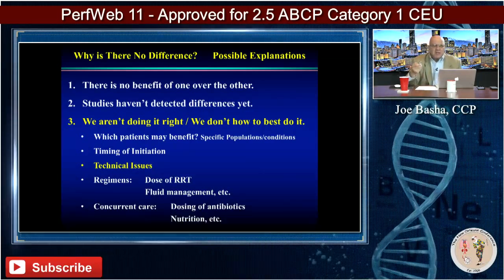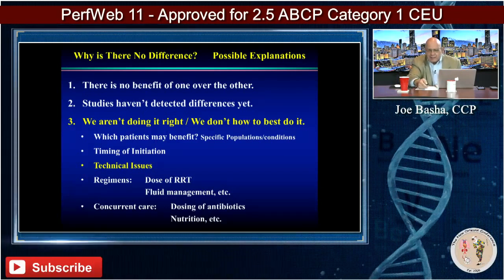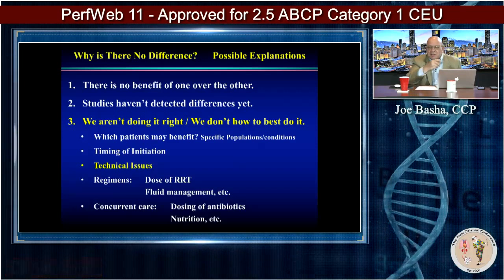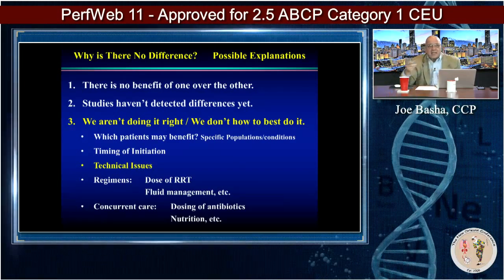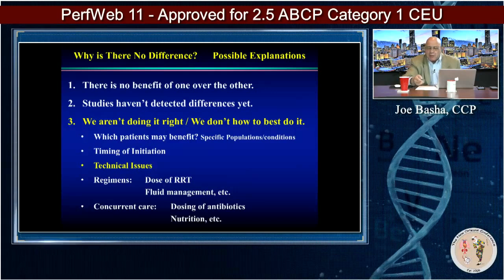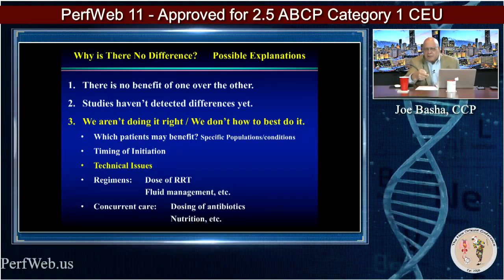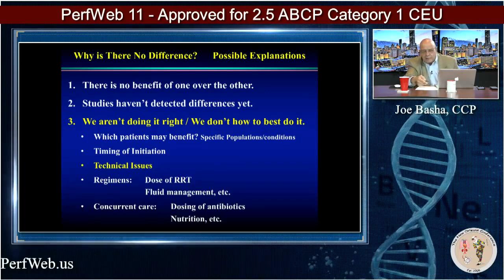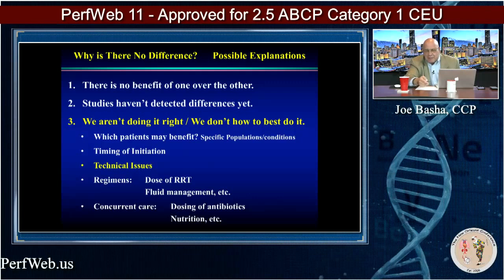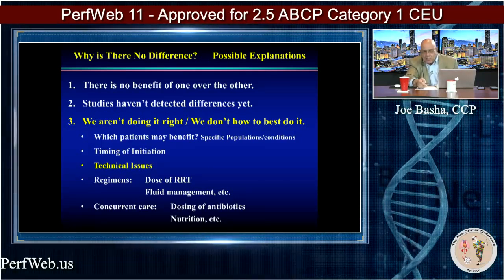Timing of initiation. We talk about this all the time with ECMO. If you wait too long to put a patient on ECMO, the benefit of that ECMO goes down and can actually get to zero, where it will no longer be of any benefit to put that patient on ECMO. When you have a patient who has acute kidney injury or massive fluid overload and leaning that direction, the longer you wait, the worse everything seems to get. So timing of initiation is hugely important.